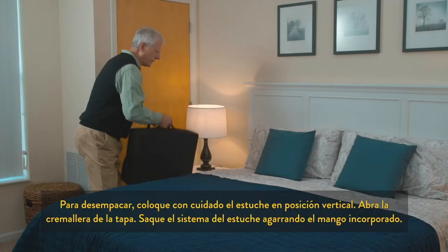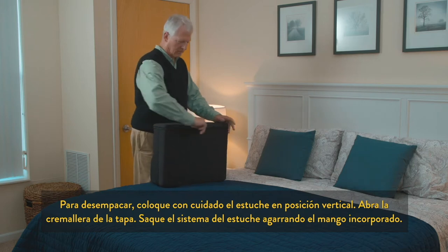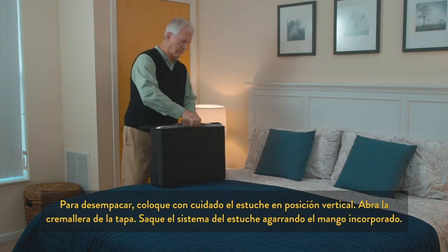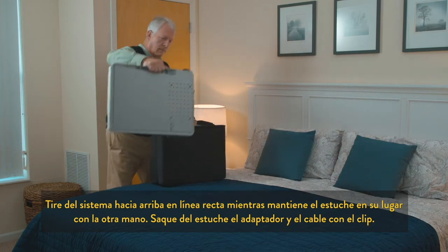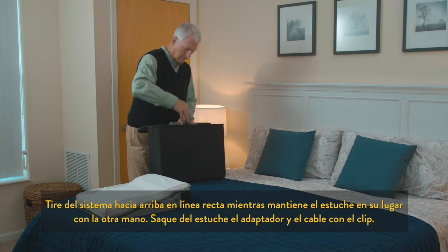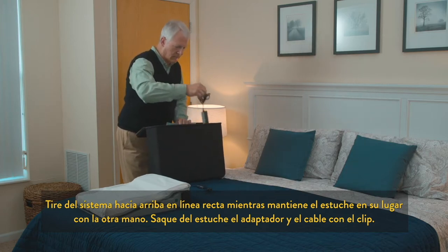To unpack, gently place the carrying case upright. Unzip the lid. Remove the system from the case by grasping the built-in handle. Pull the system straight up and out of the case while holding the travel case down with the other hand. Remove the power adapter, cable, and clip from the carrying case.